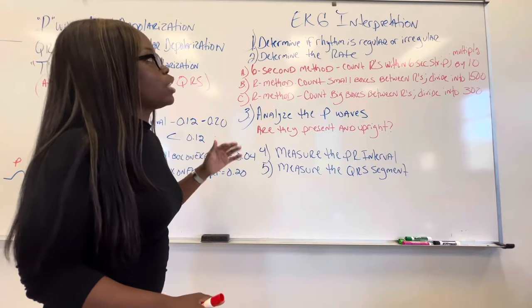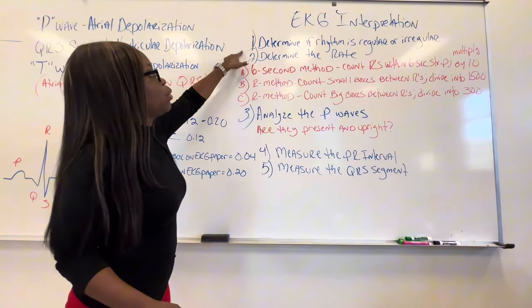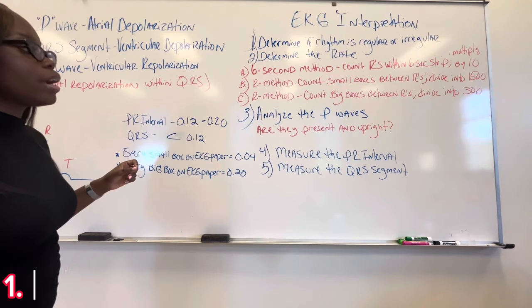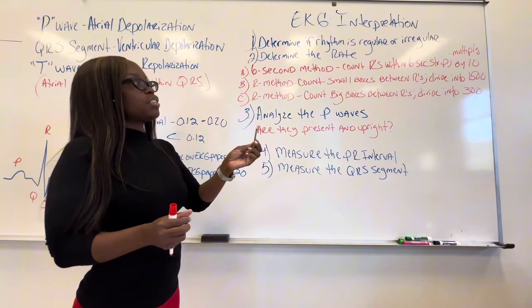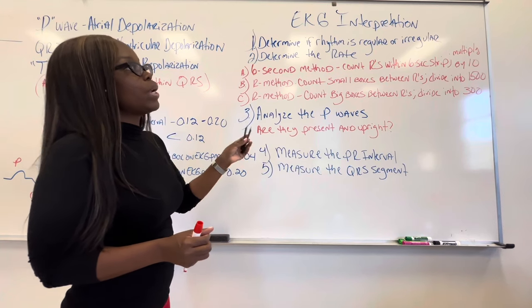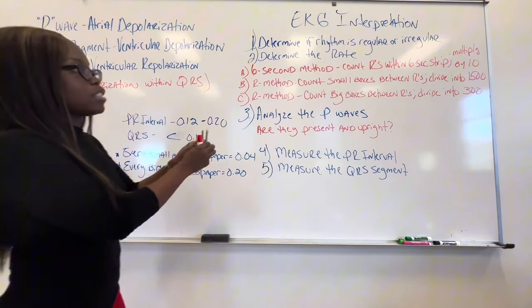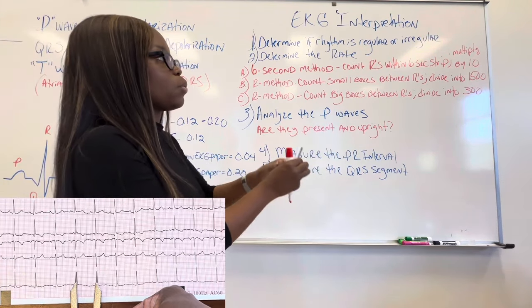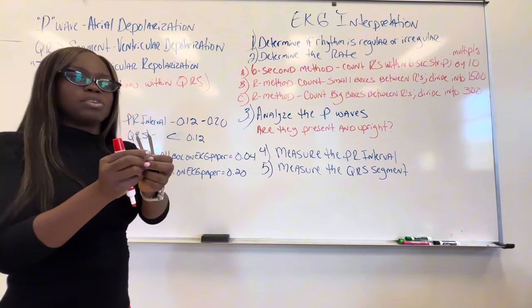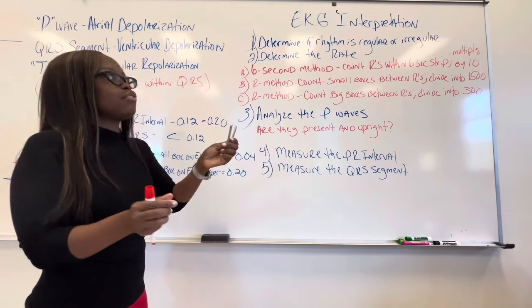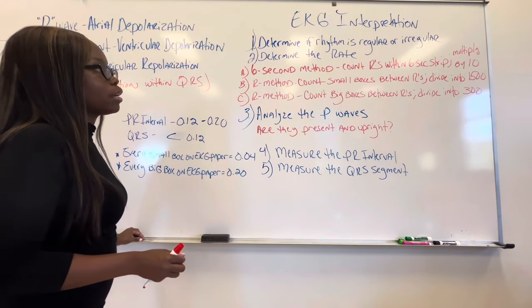Okay, so let's talk about interpreting the EKG. Now, there are five steps to interpreting the EKG. The very first thing we want to do is determine whether the rhythm is regular or irregular. And you can do that by using this caliper here. You want to just determine that the distance between each R in the QRS segment, that there's an equal amount of space in between each one. So you can count the boxes in between each R. You want to look at the rhythm to see if it's regular or irregular.